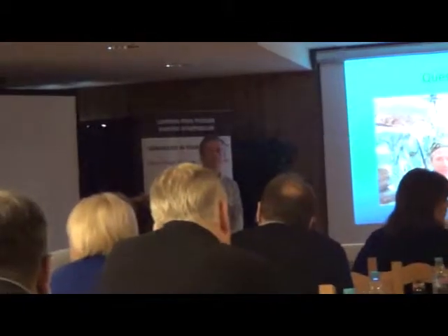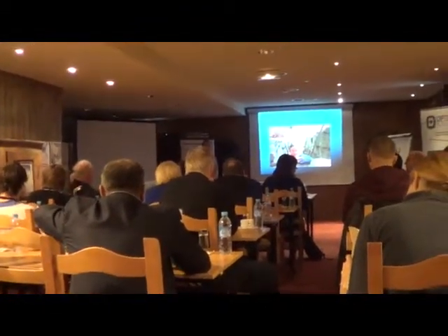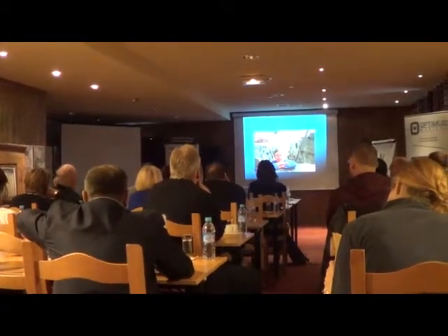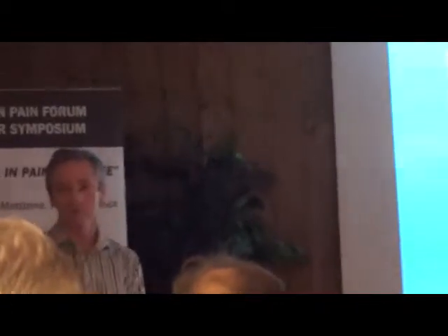Margaret and Chris, very good presentation, excellent X-ray images. I use the lateral position, with patients lying on their side. Have you got any experience with that before? With lateral positioning, no, I don't, because I sit my patients. I found the patient feels more comfortable, and I actually get better fluoroscopy views.